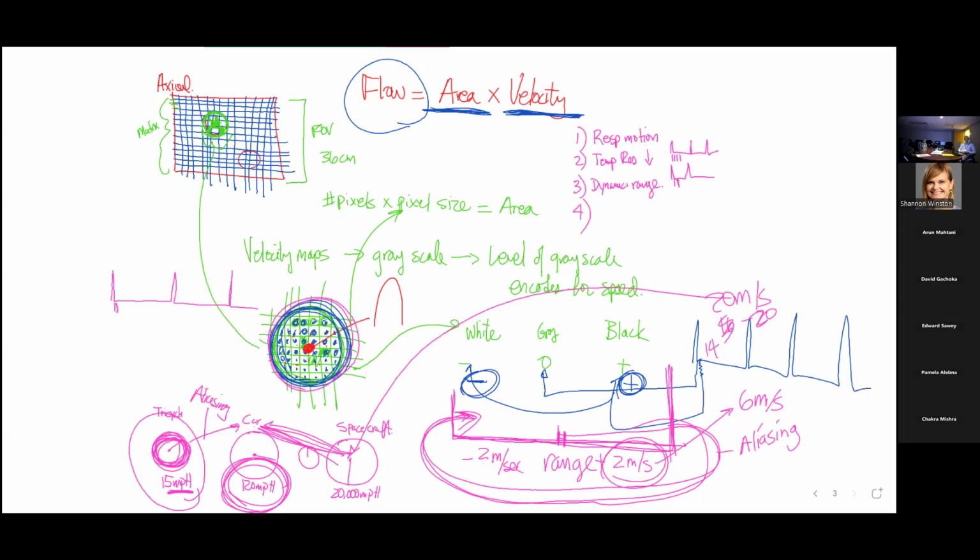And so you've got to think about also when you're doing flow measurements is the direction. And so you have opportunities to think about that. And it can be in one of three directions, right? It could be through the plane, in and out, but it could be left to right or anterior to posterior.